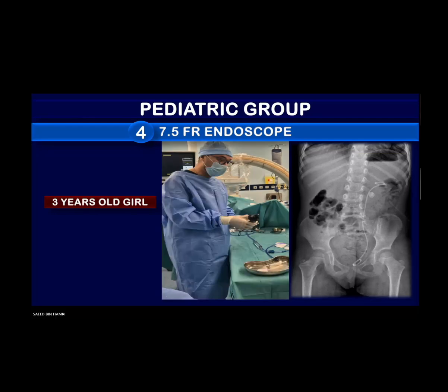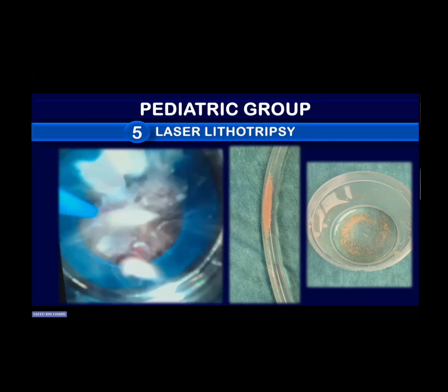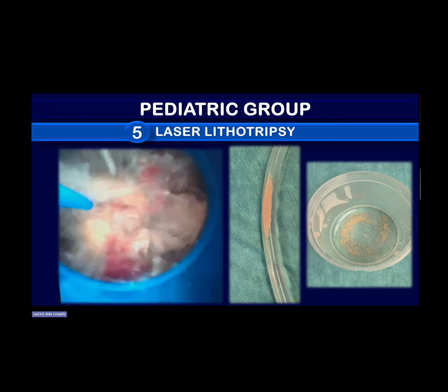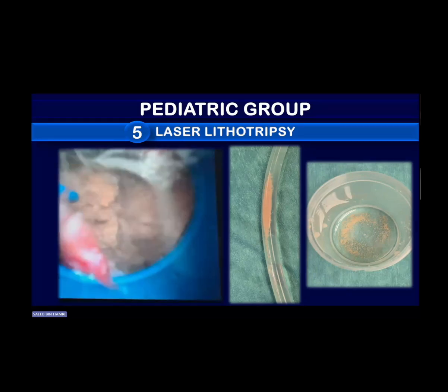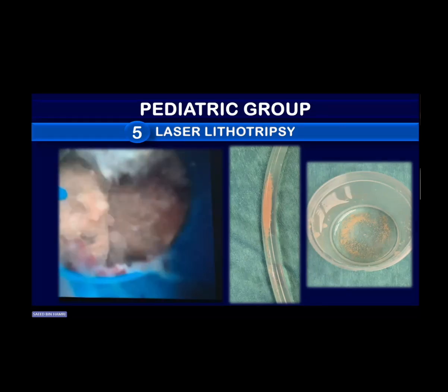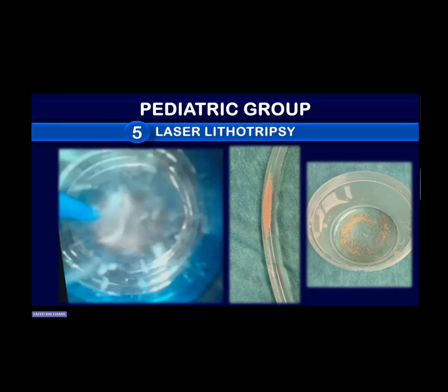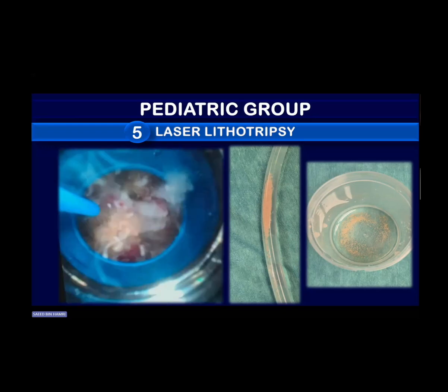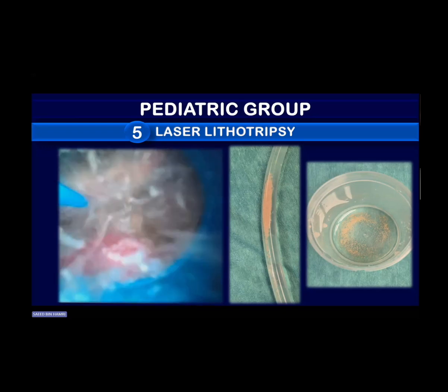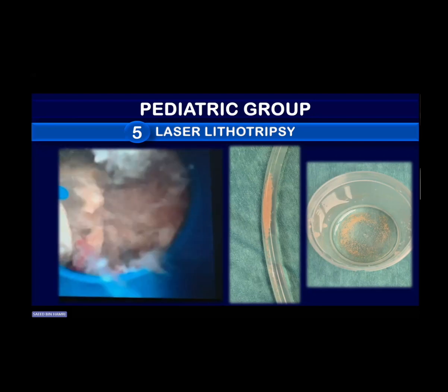Now, I explained to you a while ago how to prepare our table and then put the access sheath. And this is exactly a 3 years old with a 1.6 stone inside the kidney. And eventually by the dusting laser, look, these are new innovations. You cannot ignore them in treating certain categories of patients, especially children below 6 years old. Below 6 years old are always challenging.